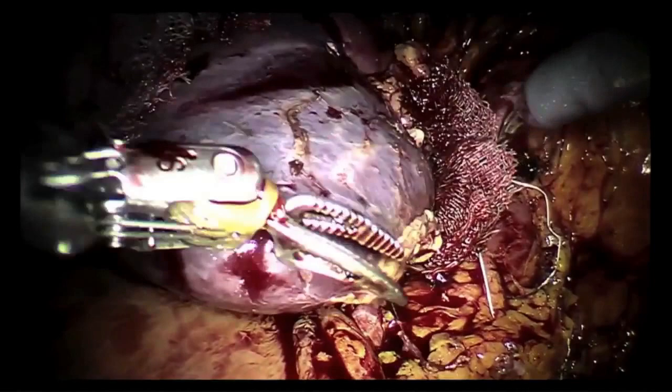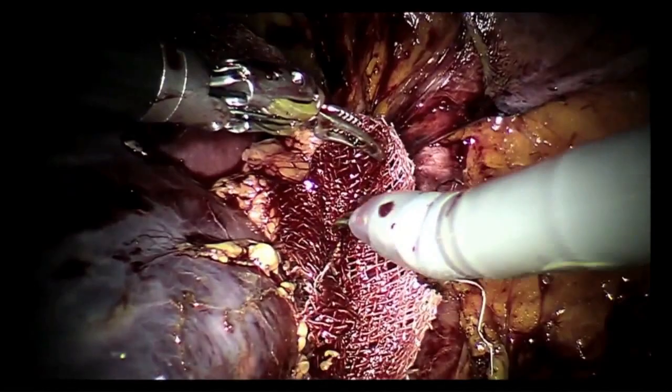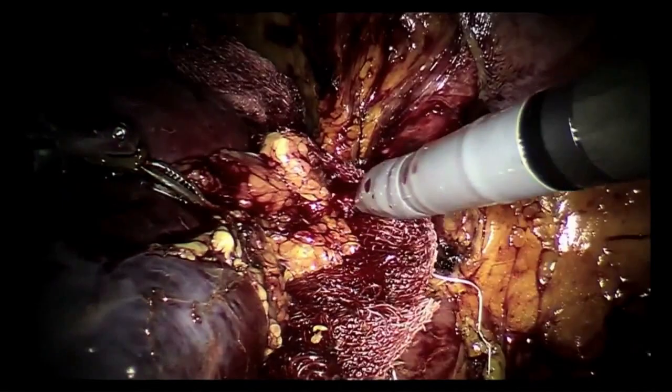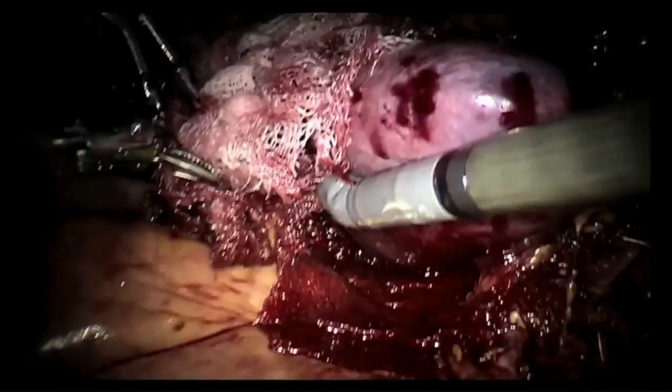Do you think the kidney will produce urine? It better. Quite quickly, or can we see it? Well, we'll see. There's still ice around the kidney, you know. We're trying to get that off. Beautiful, yeah. He's getting back his normal color.